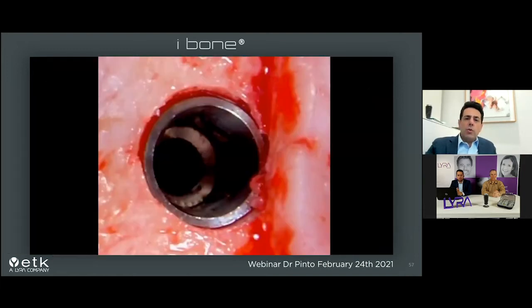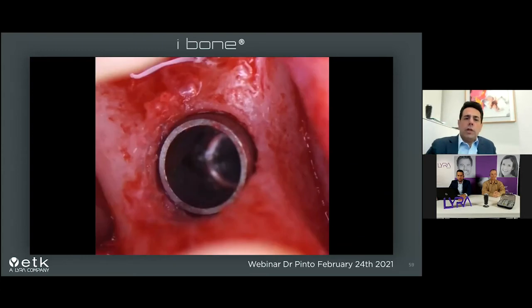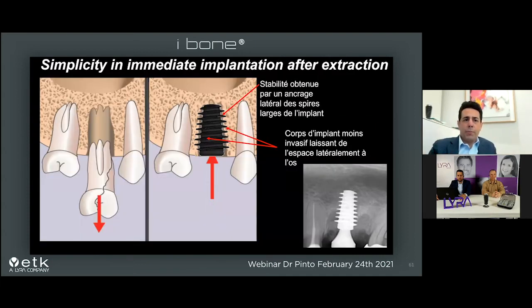It means that when you augment the image and try to focus on the contact between the collar of the implant and the cortical bone, you see that there is a little space. It means that with our drilling protocol, we let a very little space for the cortical bone to come and heal on the implant, and not to compress the cortical bone. It's not the same objective on the cortical bone and on the alveolar, cancellous bone. And we see on this other picture, we let a very small space, very thin, but it can provide a very good healing of the bone around the implant at this moment.